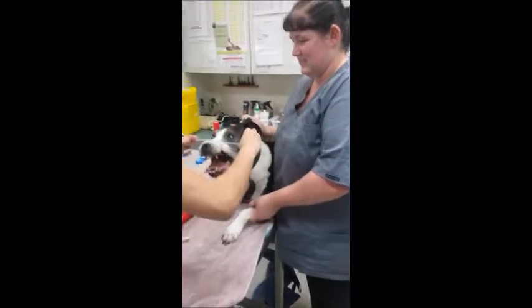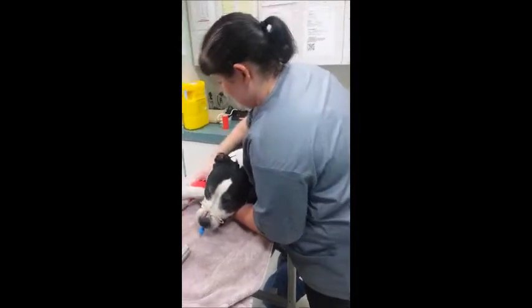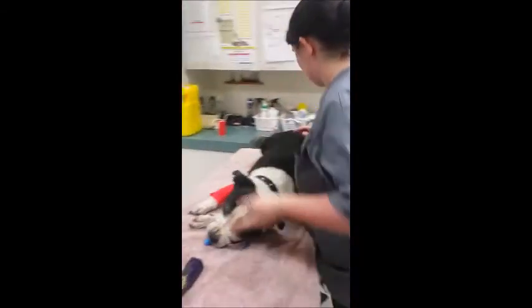Once the tube has been placed, it is secured with a tie. Once the tube has been secured, I move the patient into lateral recumbency.